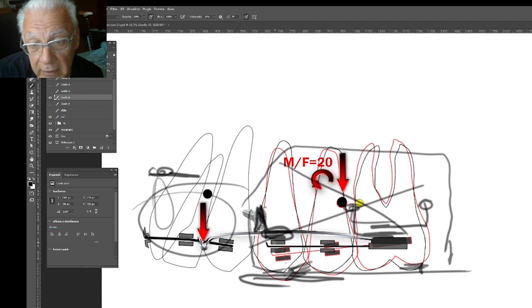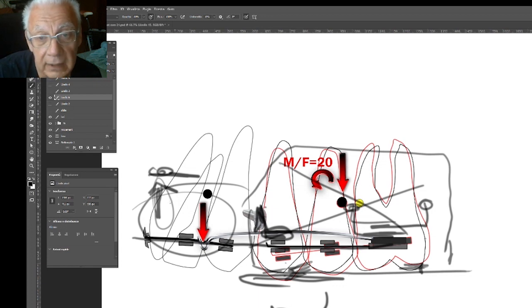It could be different if you are working on a continuous arch wire. In fact, if you have a TAD here and you apply a vertical force here, then you have a whole arch, and what you are trying to get, I'm not sure you can get it every time because it's a big unit, it's a rotation of the whole arch. So you are just changing the inclination of the occlusal plane. But personally, I'd rather use a segmental approach to this. That's another topic.